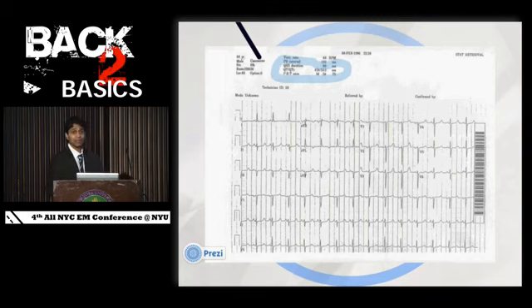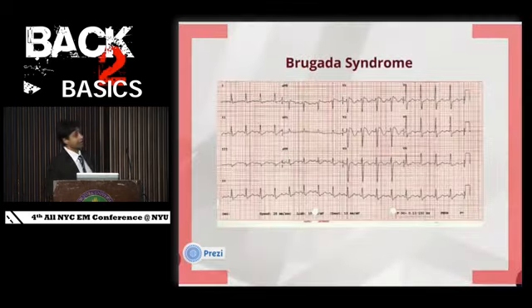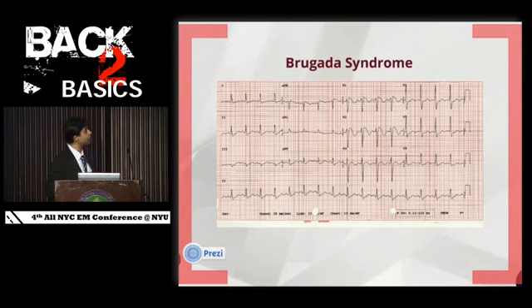All right, so important point. This is how you're going to save someone's life. If you get an EKG that looks like an RSR prime or an incomplete right bundle, you should be thinking Brugada syndrome, especially if you see a little ST elevation there. This is a channelopathy, which causes people to pass out because they have a polymorphic VT, which is usually transient. So look for this, and most of us can't remember what this always looks like, so you look it up.